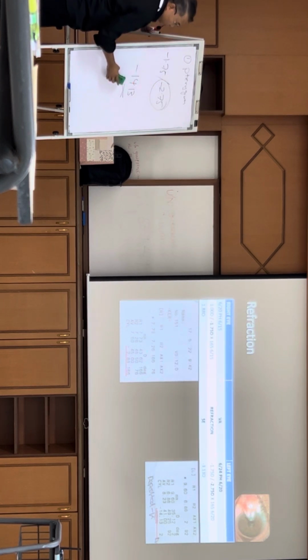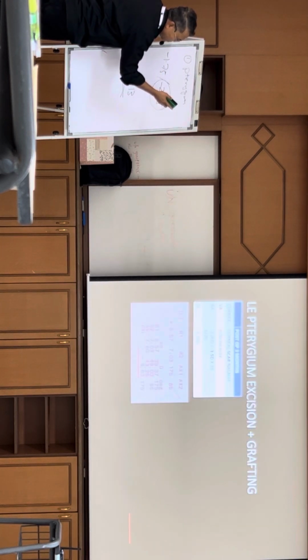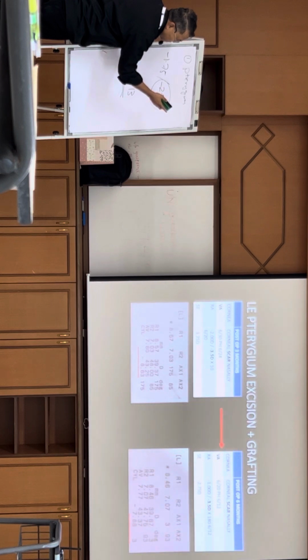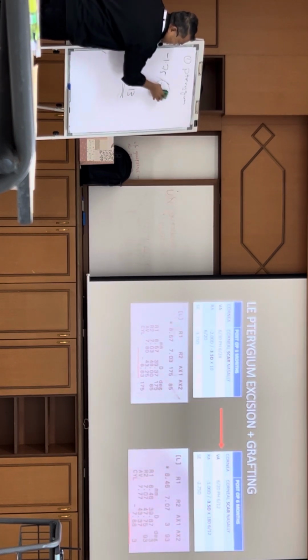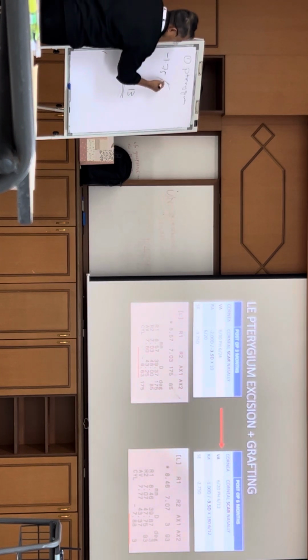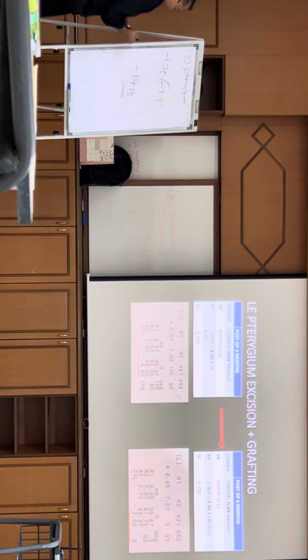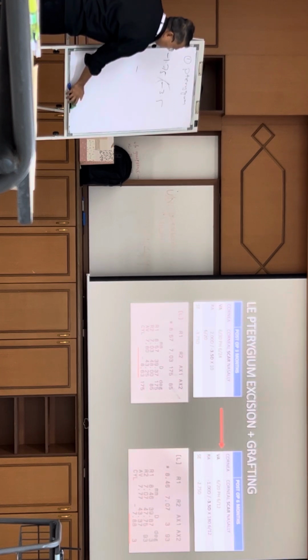Now then Dr. Akmal removed the pterygium. After that, once you remove the pterygium, then you see this. Is that correct? This is actually 6 months post-op, eh? So you have minus 3.5. And then immediately you have seen the stabilization of this into minus 7.88.